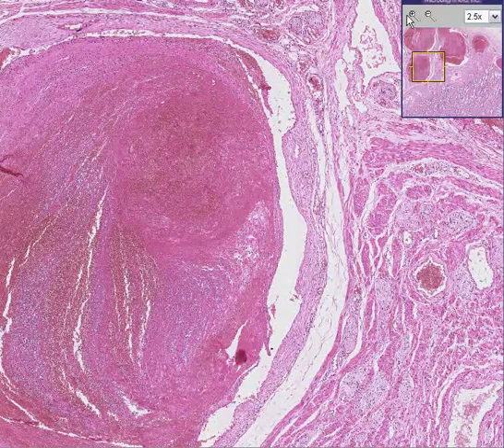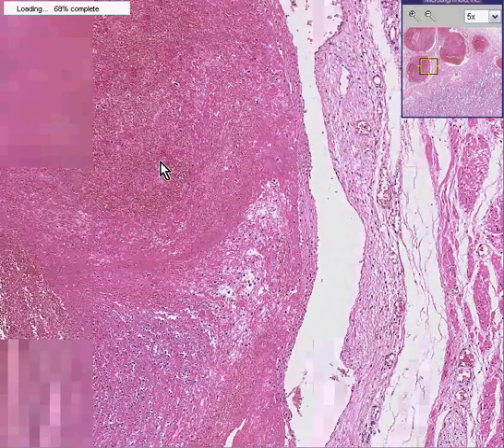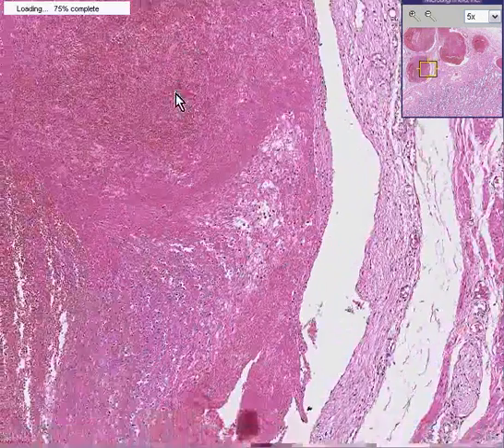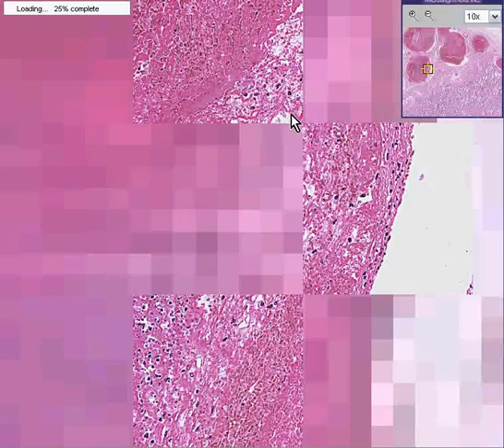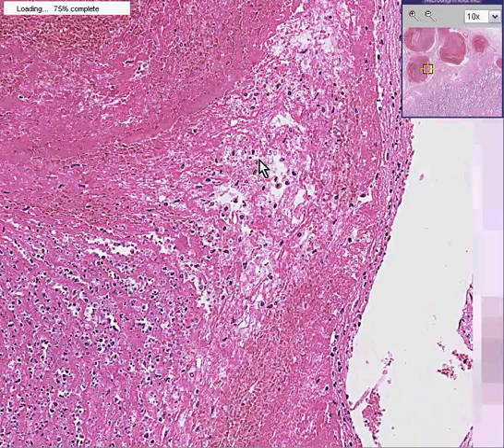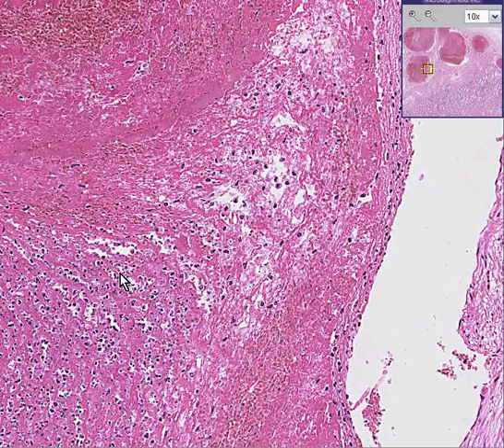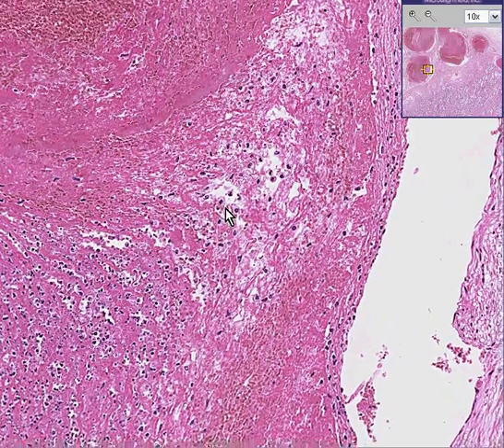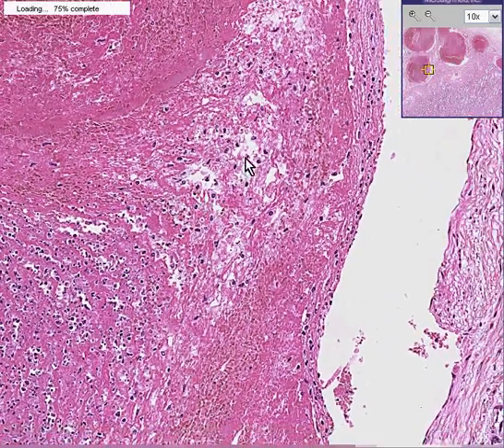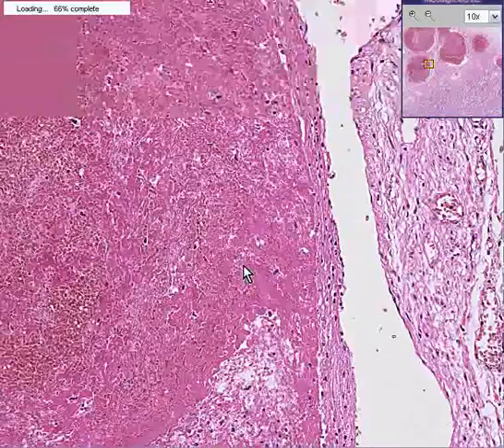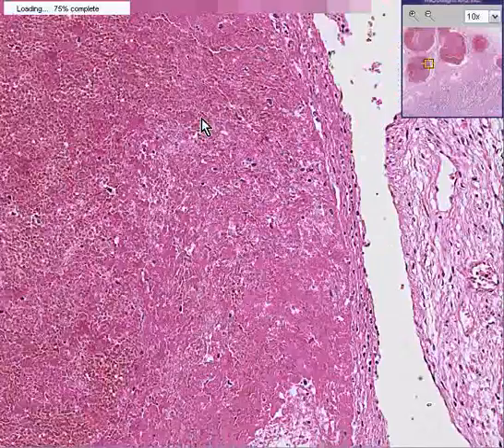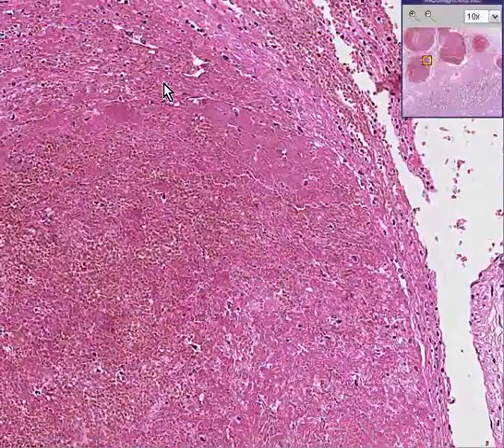But when the blood clot starts to get some ingrowth of not only inflammatory cells, but perhaps endothelial cells — like blood vessels starting to grow into it — we call that an organizing blood clot.